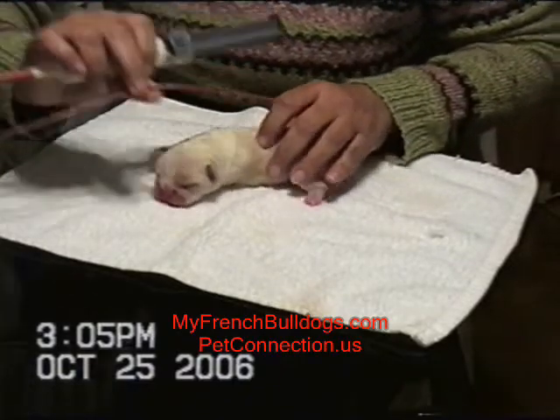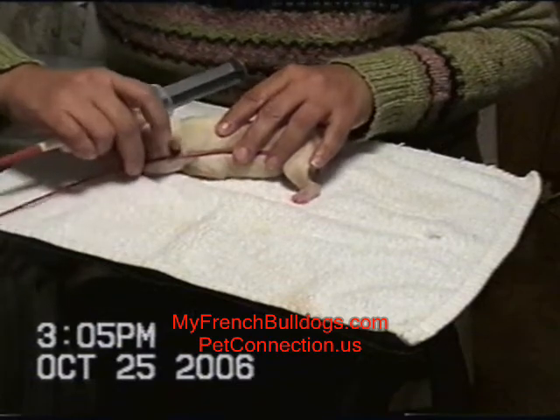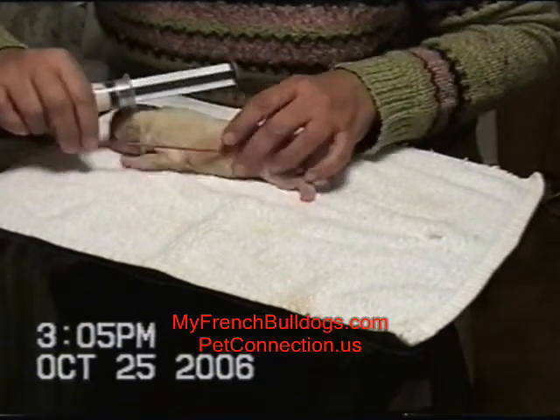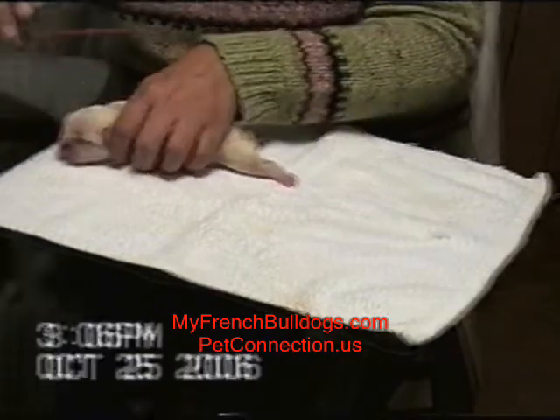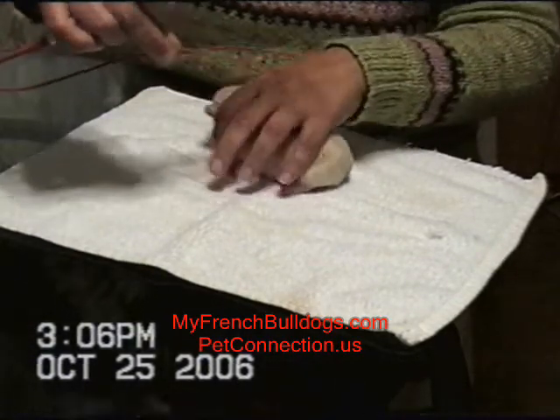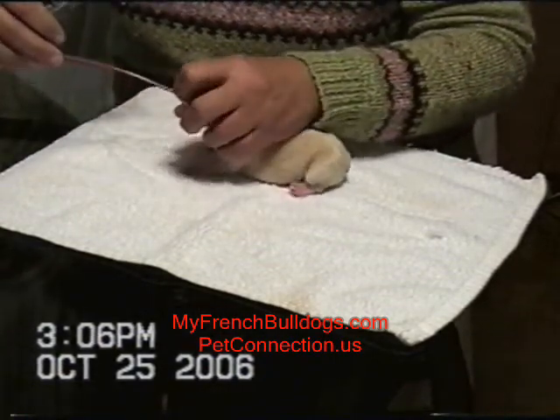To see where we want to put the tube to make sure we put it in the proper place, you want it to go to the stomach. You don't want it to go any shorter or longer than that. So you see I'm putting the tube beside the puppy, and I take the tip down to the bottom rib, and the other end is at his mouth. I will mark where his mouth is with a magic marker so that I can remember.